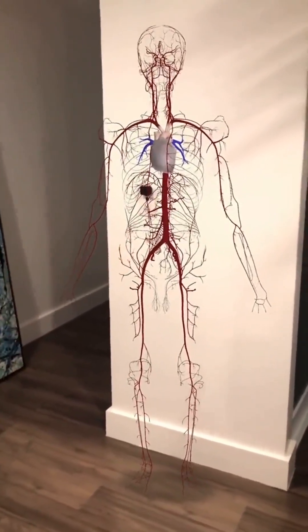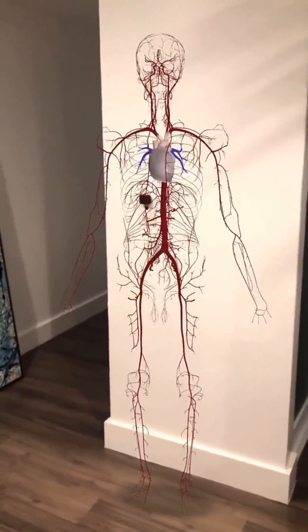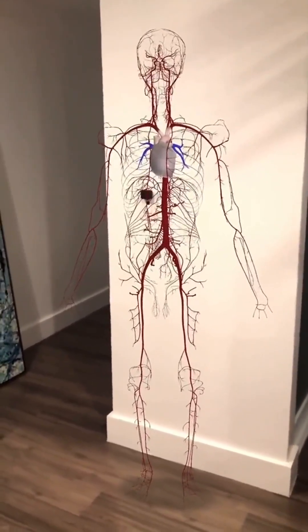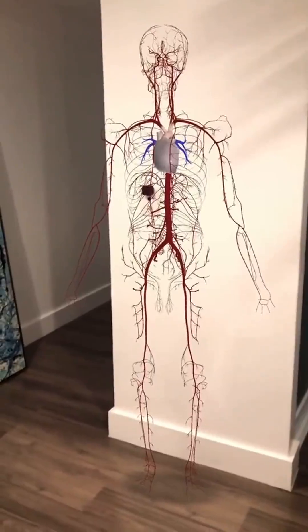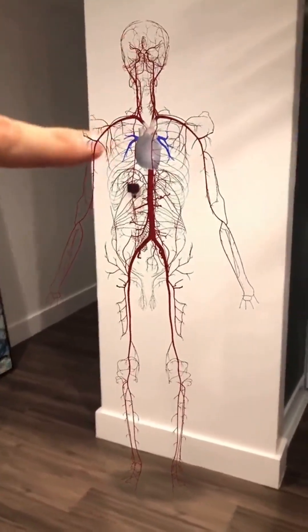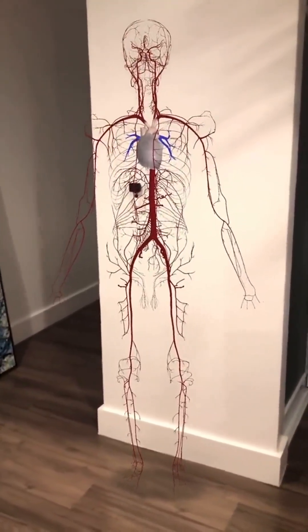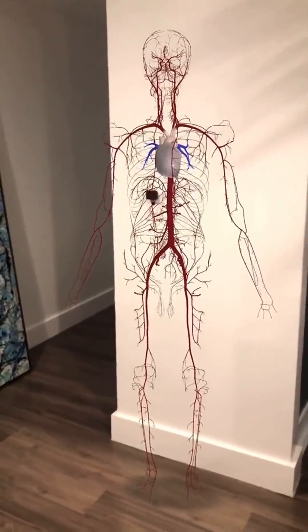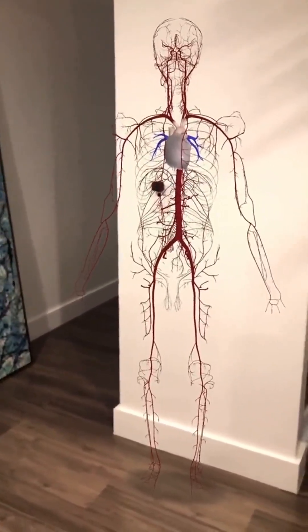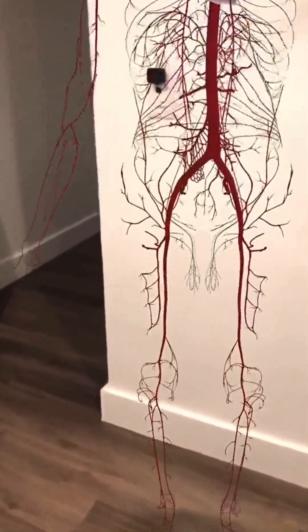You can see that the femoral is a lot larger than the radial. Technically you can use the brachial artery or directly puncture the carotid, but that's very risky and I have never done it and don't want to do it.